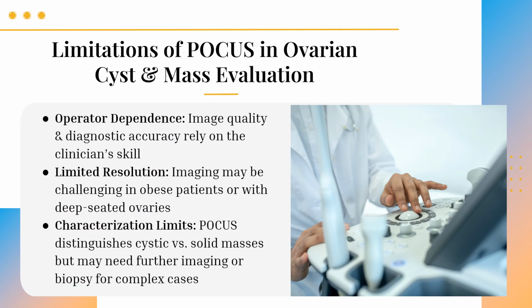There are challenges if you're nervous, you're anxious, you're not skilled and qualified, or you haven't done ultrasounds in a long time. If you're a medical student or a resident, you're going to have a lot of challenges with quality based on the operator, and limited resolution based on the patient's obesity, the location of their ovaries, and their pain level. If they're all over the place moving, you need to be able to visualize well on the ultrasound.